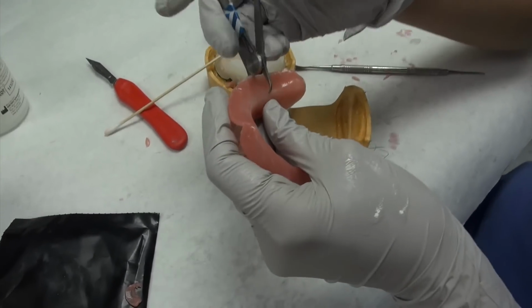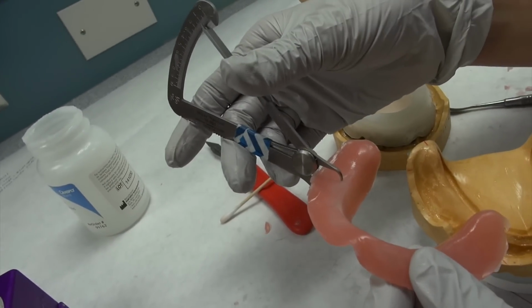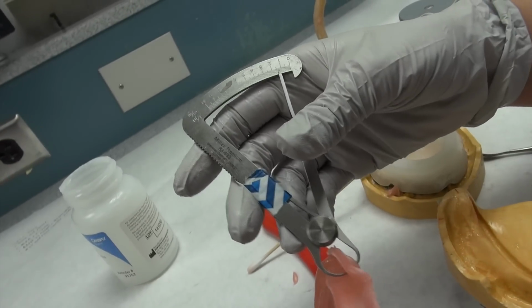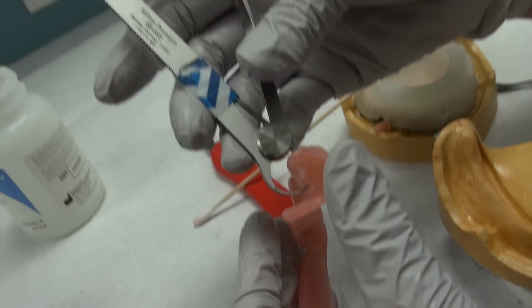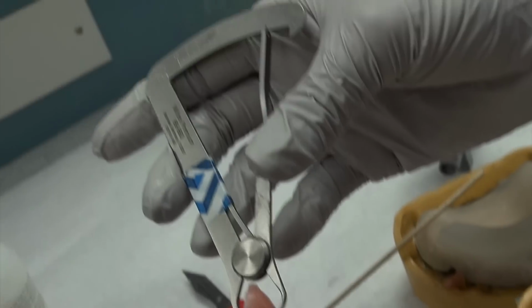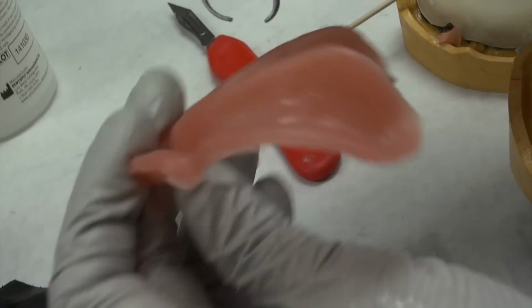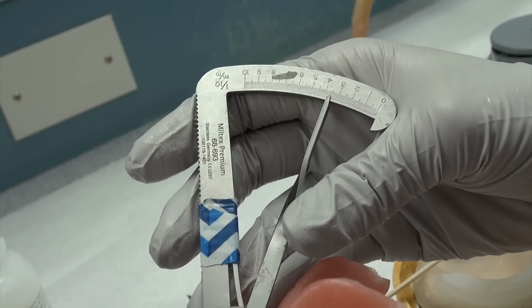Good. So when we come over here and we measure, see we're getting 1. Okay, and do you see how that was the area that I said was closer? Here, about 1.2. Okay. And see the area I said was too thick? 2. All right, but let's see where we are on the retromolar pad. Bam! 2 exactly. See that? How about here? Ooh, just over 2. 2.1. What about here? 3.5.